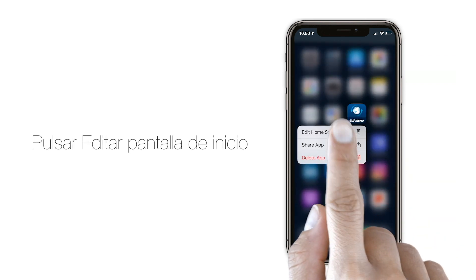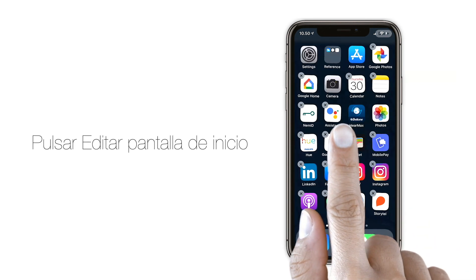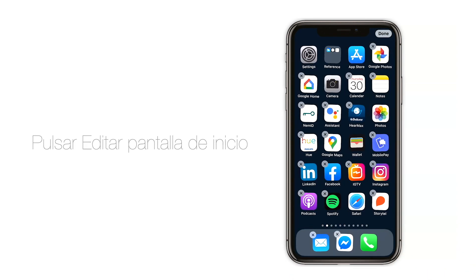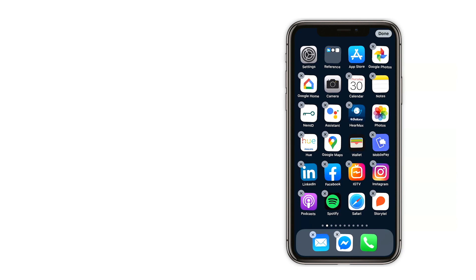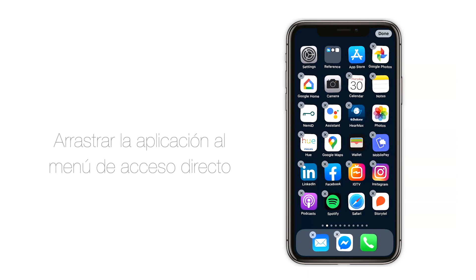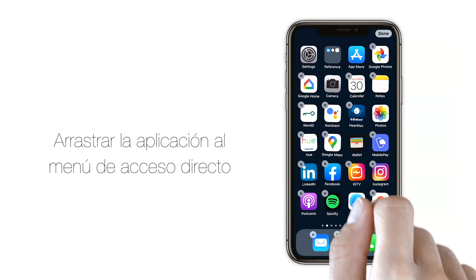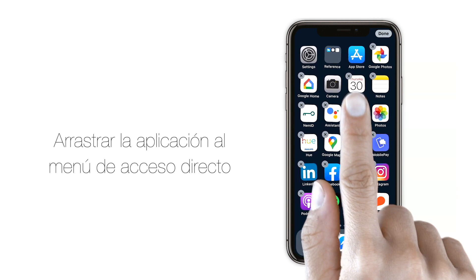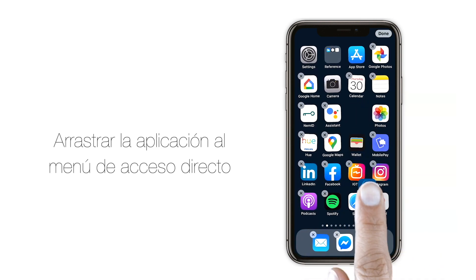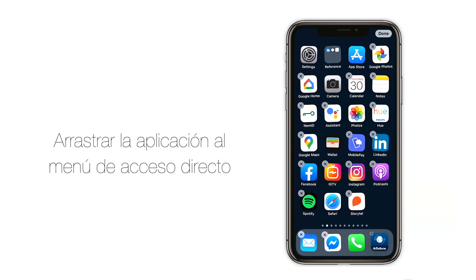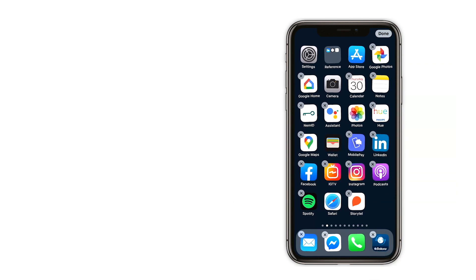You will see that the app icons are moving and they can now be placed freely. Hover your finger on the Smart 3D icon and drag the app to your shortcut menu.